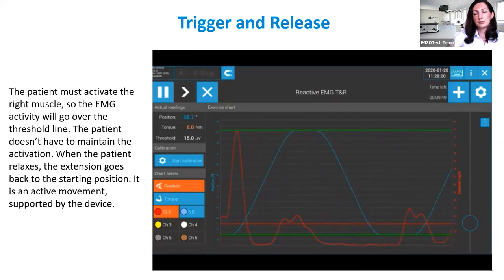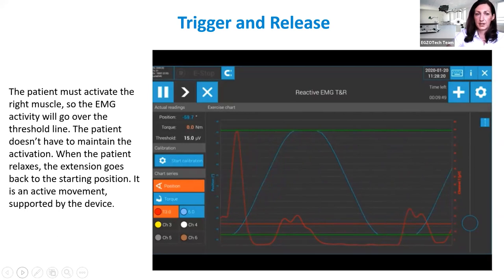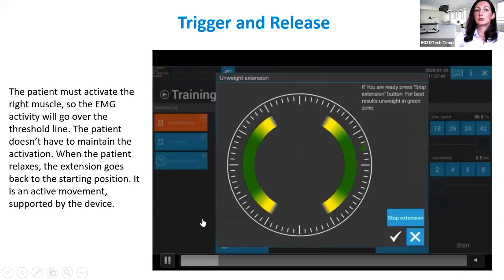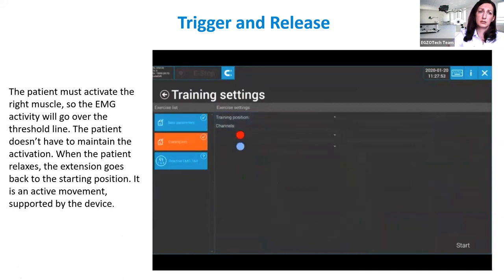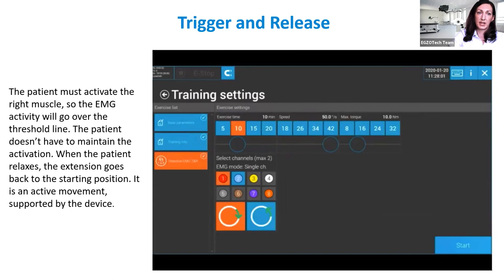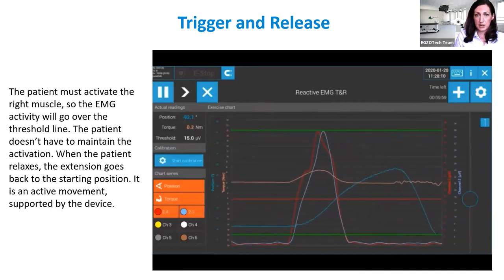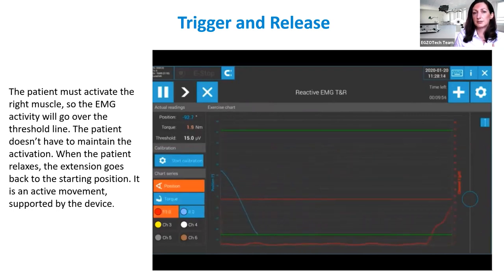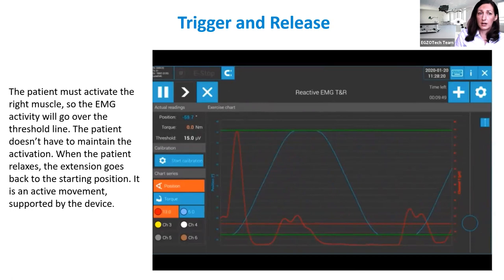EMG trigger-and-release is an active movement of the patient supported by the device. Trigger-and-hold is a higher-level program: the main difference is that the patient needs to generate activity exceeding the threshold line and keep the activation throughout the entire range of motion — not just initiate the movement but maintain the contraction. If the patient relaxes before reaching full range of motion, Luna will stop or move back down. This is much more engaging for the patient than trigger-and-release.